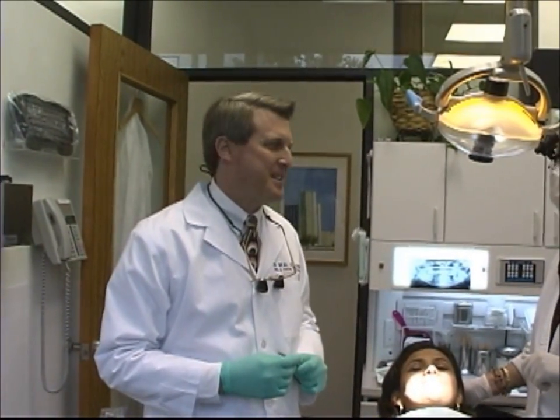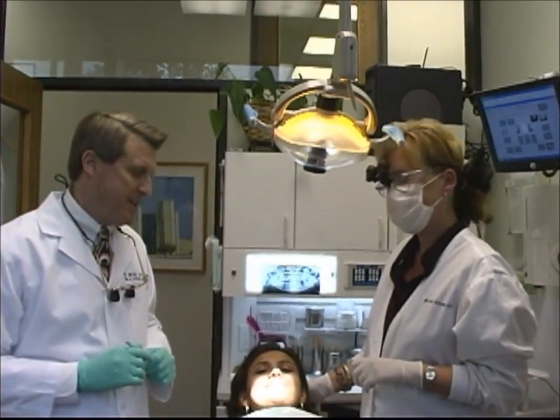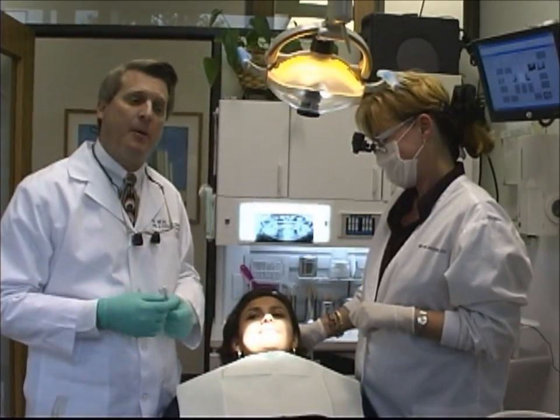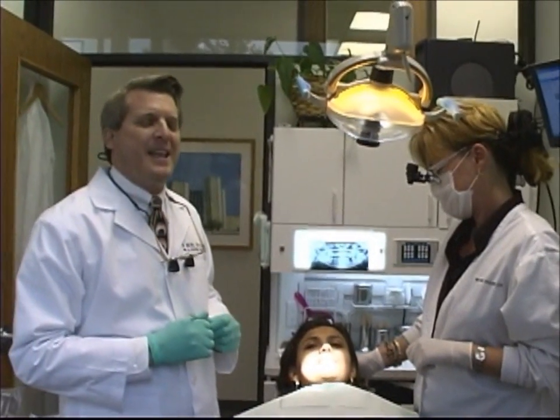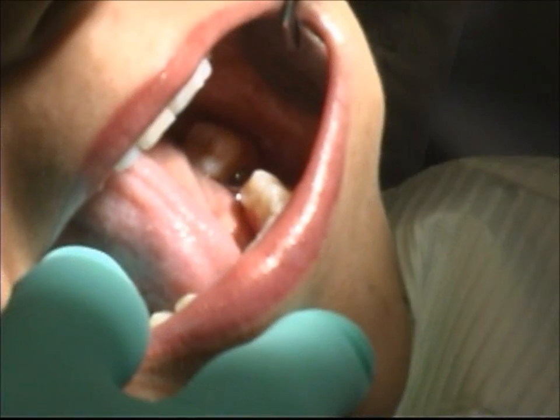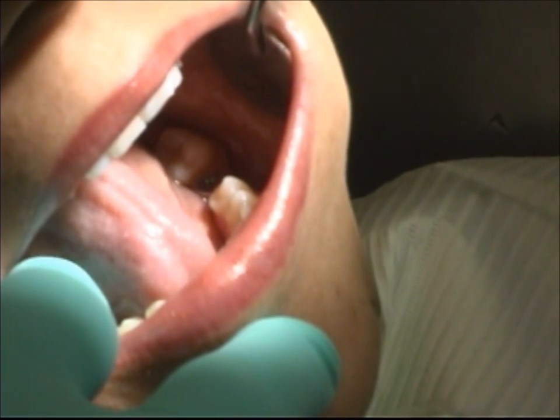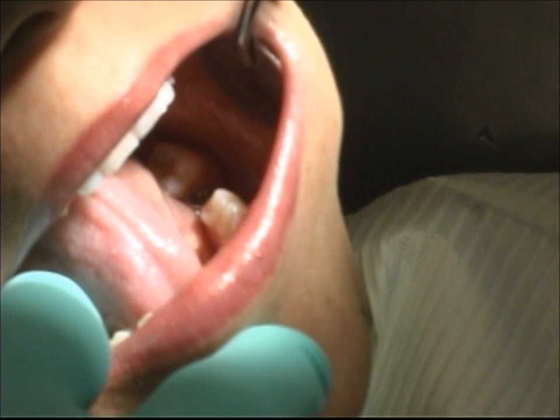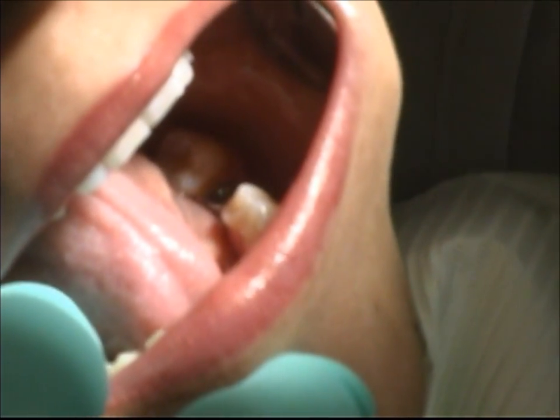We're back again. Let me introduce a couple of my assistants: Maggie Jody, who's been working with me for approximately six years, and Alma Macias, who's not only one of our assistants but our patient, and she's been with us approximately five years. Alma has an implant in area number 19, and we're going to demonstrate the triple tray or dual arch impression tray. We have a healing abutment on a Noble BioCare 4.3 internal implant, and we're going to go through the steps of restoring it.